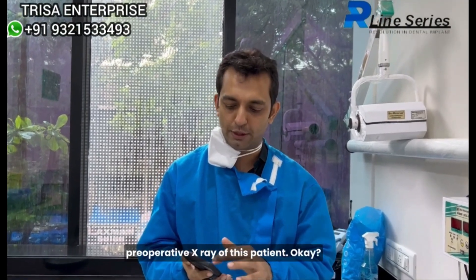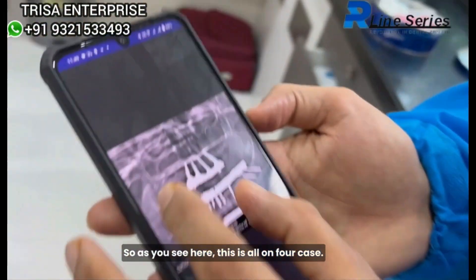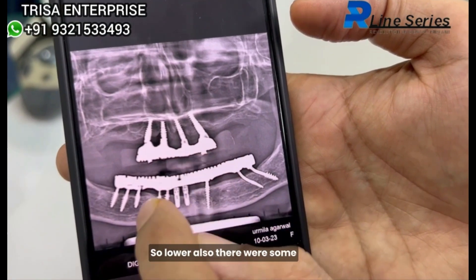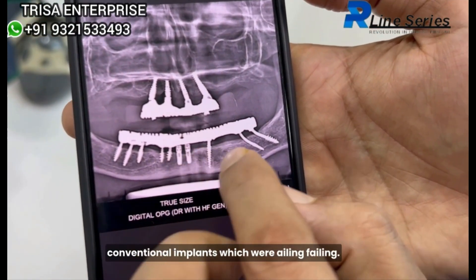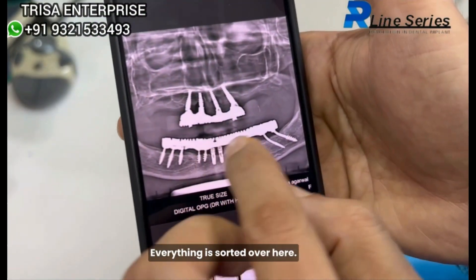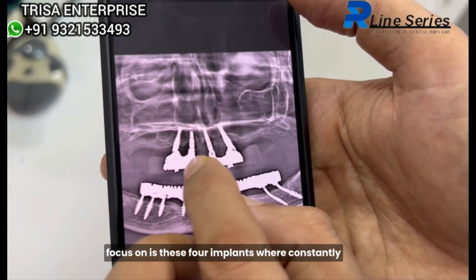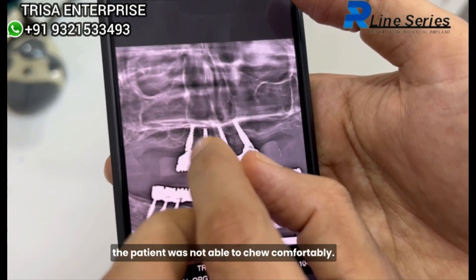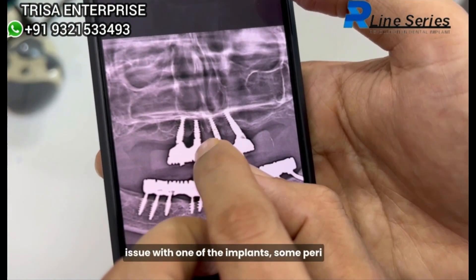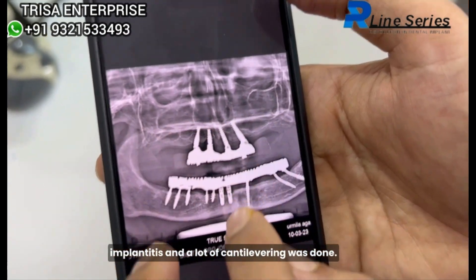Let me quickly show you the pre-operative x-ray of this patient. As you see here, this is an all-on-four case. On the lower there were some conventional implants which were R-Line, and as you see this is now almost three years follow-up. Everything is sorted here, but today what I want you to focus on is these four implants where the patient was not able to chew comfortably, and if you see here there is an issue with one of the implants — some peri-implantitis and a lot of cantilevering was done.